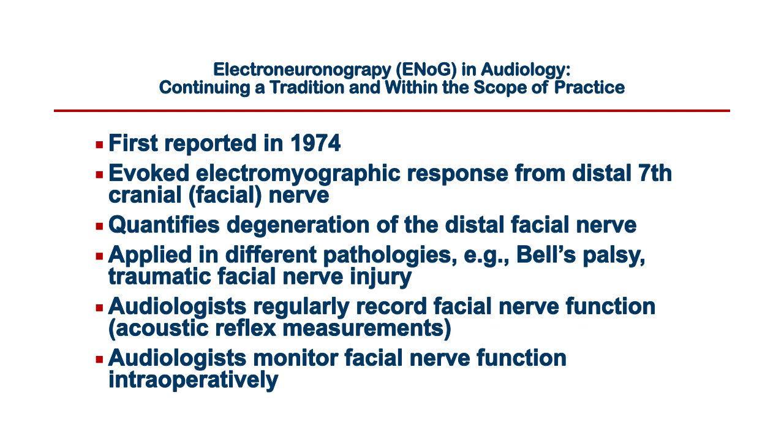And he came back from a conference and he said, Jay, have you ever heard of ENoG, electroneurography? I said, no, I really haven't. He said, well, I just came back from a meeting where I heard a fascinating presentation on ENoG and how it can be used in patients with facial nerve paralysis and how it can be very useful in determining what kind of management the patient needs and really documenting the extent of the paralysis and whether it may recover or not. He said, do you think you could record ENoG in our clinic? So obviously I'm the director of audiology in the clinic, and he's the chair of the department.